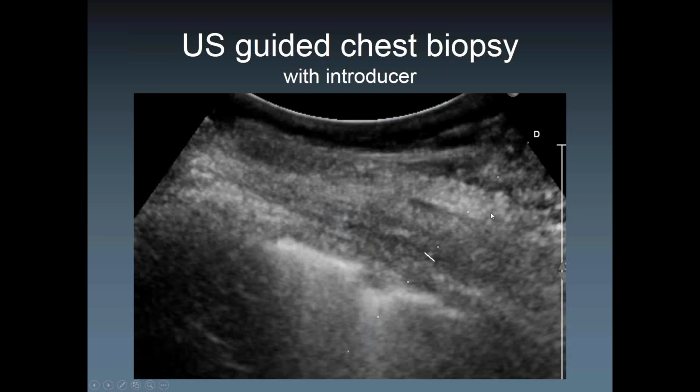With ultrasound, it looks like this. So first one, you don't see anything, right? This is like the chest wall here. This is the pleura. And then you see this little cavity here, this kind of notch. And that's a target. And there's lung around it, so you don't have much space. So from dot to dot, here's 1.3 centimeters with this vendor. It's not 1 centimeter, just so you keep that in mind. So it's less than 1 centimeter throw length, but it works.